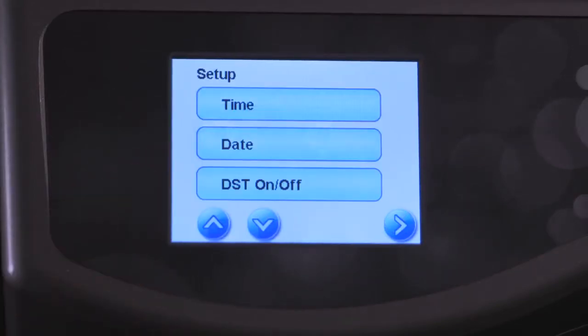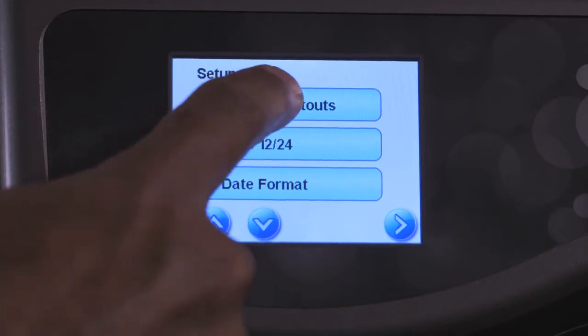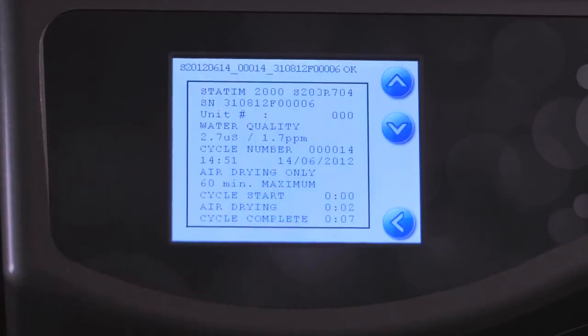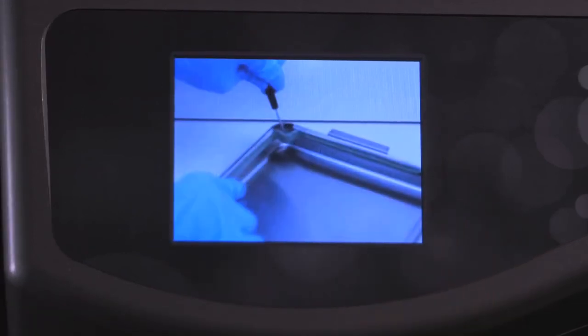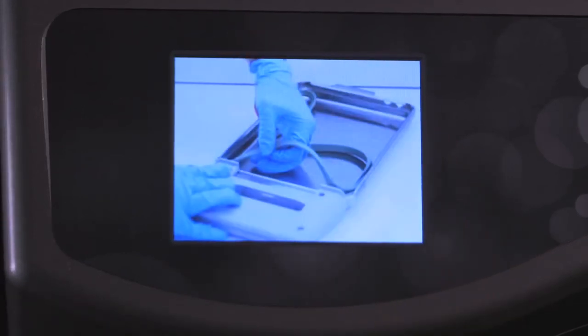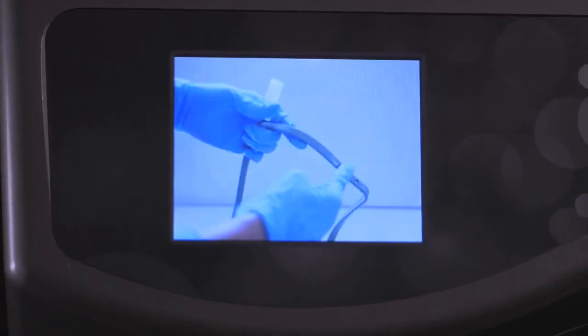Should the completion of a sterilization cycle ever be in question, the last five cycles are available to view directly from the color LCD screen. While the Statum G4 is designed for ease of use, if clarification on any aspect of operation is required, instructional tutorial slideshows are available to view on the bright, high-resolution touch screen.